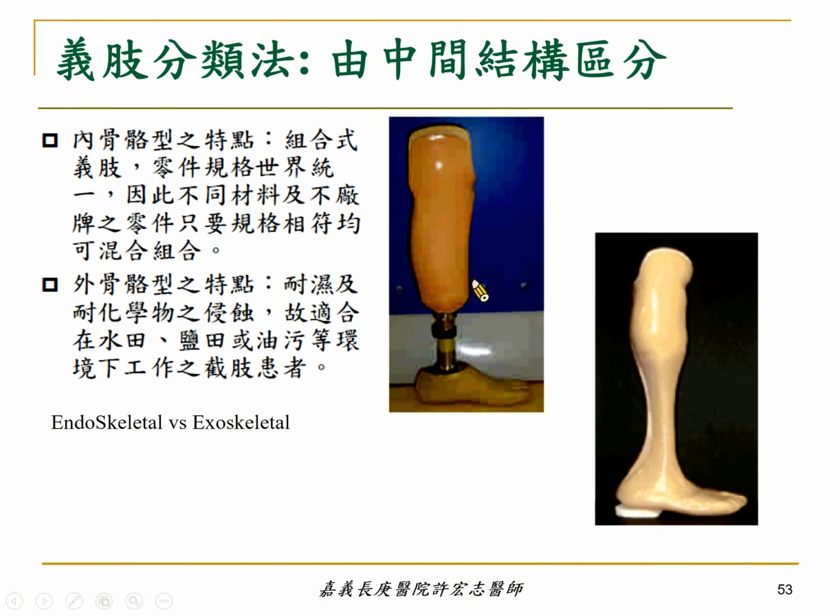What is the advantage of the endoskeletal prosthesis? Endoskeletal prosthesis components are universal, so that you can use different prostheses from many other countries or many other factories and use them together in the endoskeletal system.